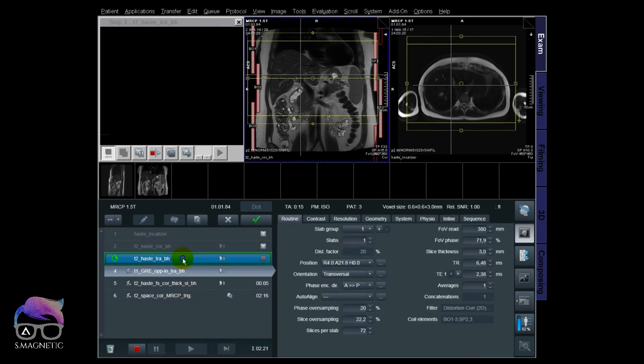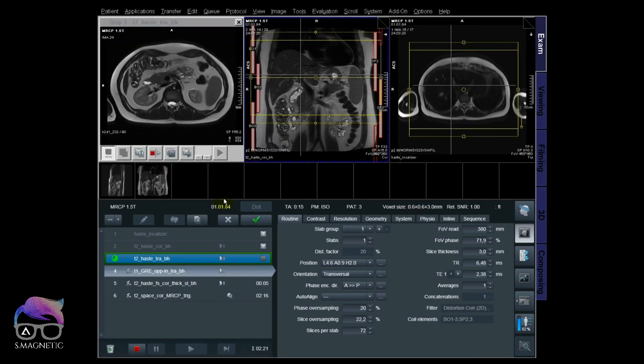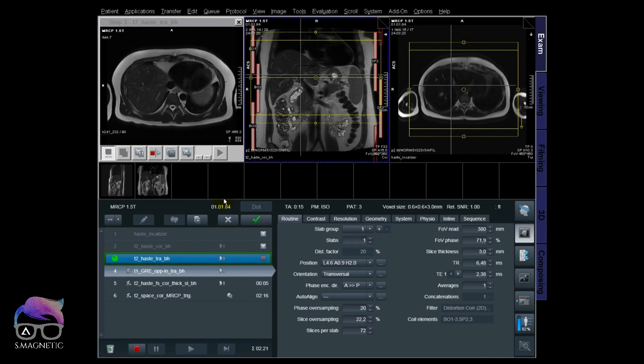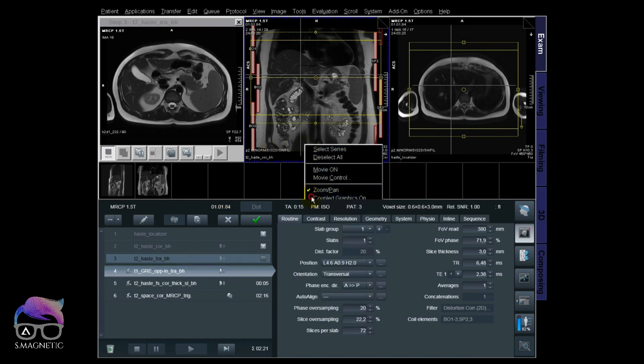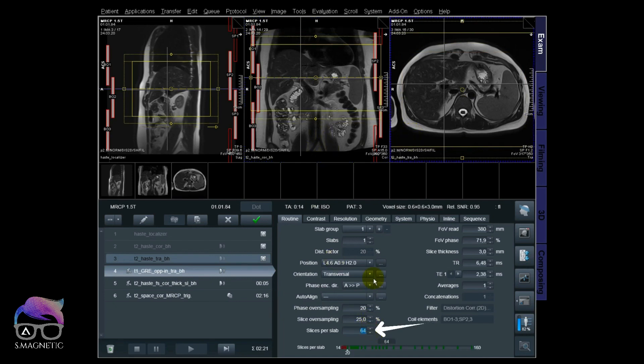Now I'm making the T1-weighted spoiled gradient in/out of phase ready by copying the HASTE transversal I already positioned. I like to have a couple of graphic overlays on to move all the boxes together during the exam — it's very effective. I can also go from 72 slices to 64, since the liver top to bottom is not that long, saving scan time and shortening breath holds.